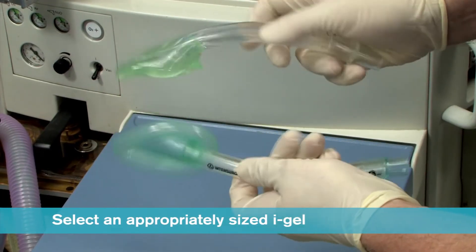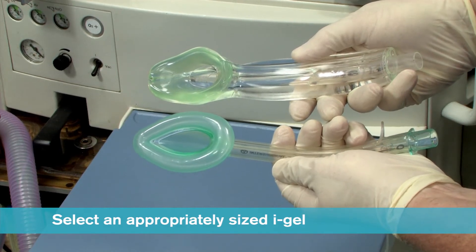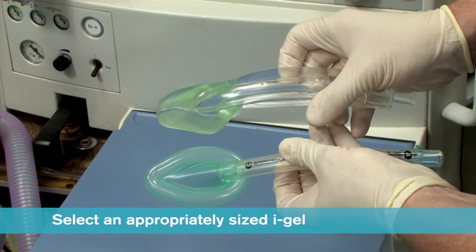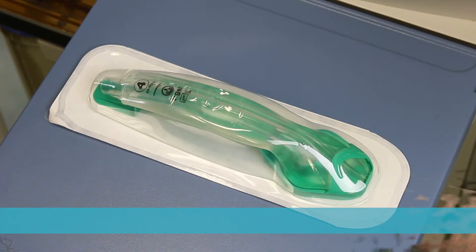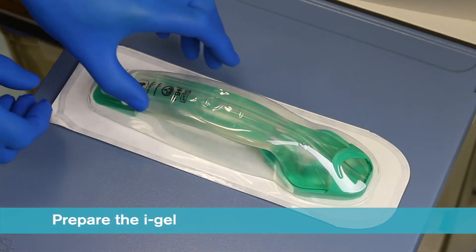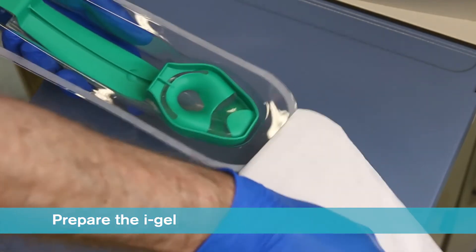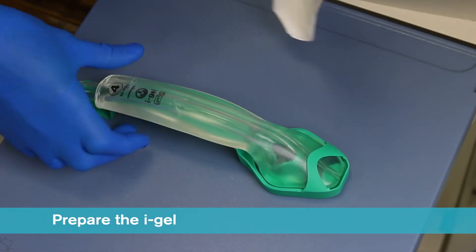When selecting size, it should be remembered that the iGel cuff does look smaller than the corresponding size of many traditional supraglottic airways with an inflatable cuff. Ensuring that you conform to local policy for hygiene, open the iGel package and take out the protective cradle or cage pack containing the device.